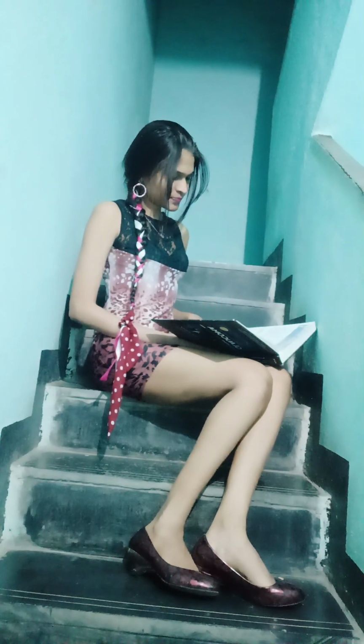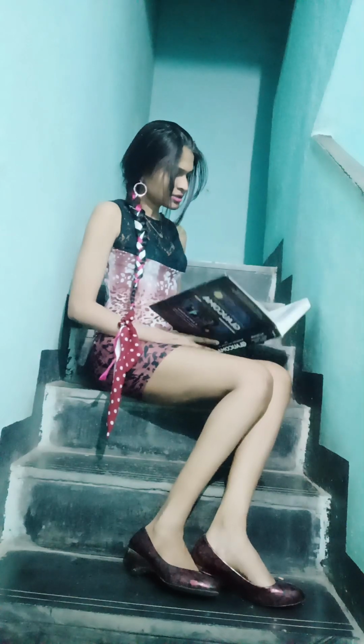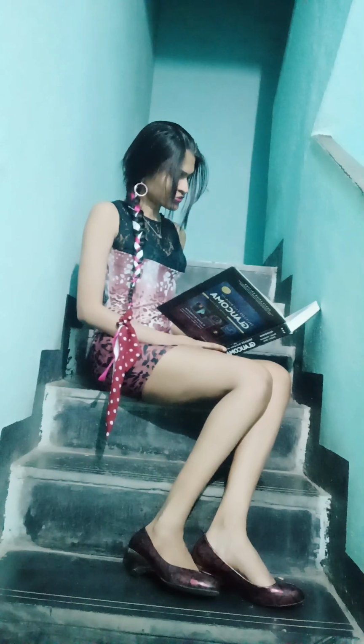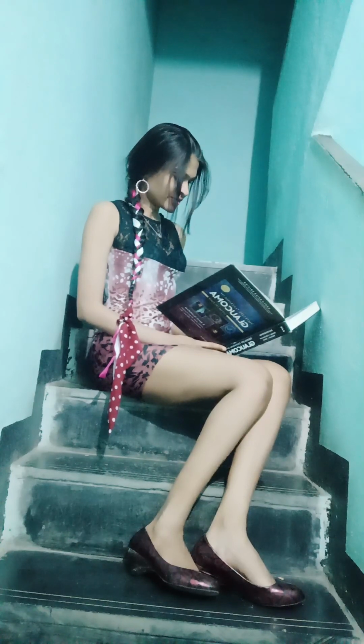Principle of gonioscopy. In healthy eyes, the angle cannot be visualized directly because of the optical principle known as the critical angle. The critical angle is related to the properties of light passing through media with different indices of refraction. When light passes from a medium with a greater index of refraction to one with a lesser index, the angle of refraction R is larger than the angle of incidence I. When R equals 90 degrees, I is said to have attained the critical angle.